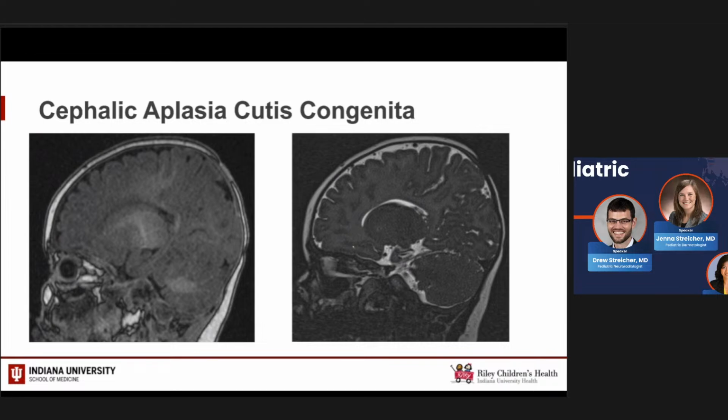So let's see, is Paul on? Yeah, I'm here. Can you hear me? Oh, yeah. Can you just describe what you're seeing on these two images? Looks like we have, let me zoom in here on my phone, some MR images. Looks like we have T1 weighted, T2 weighted as well. Sagittal views through the midline, maybe a little lateral to midline.